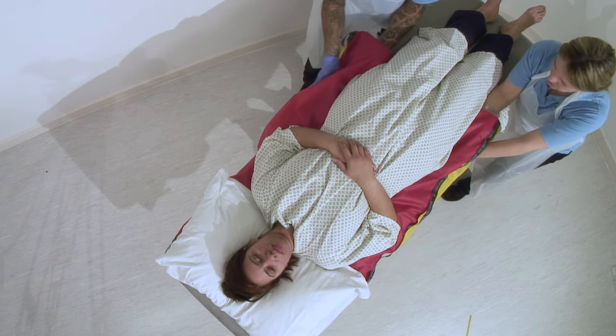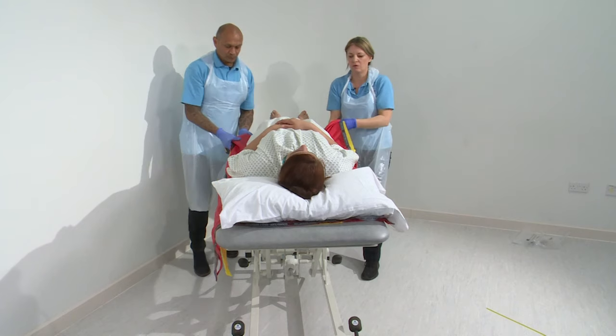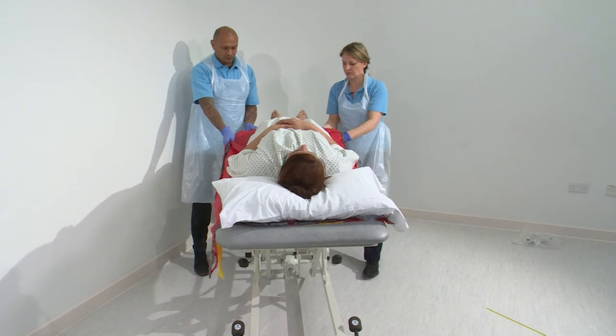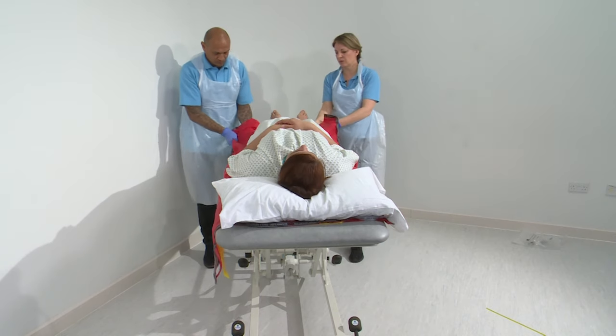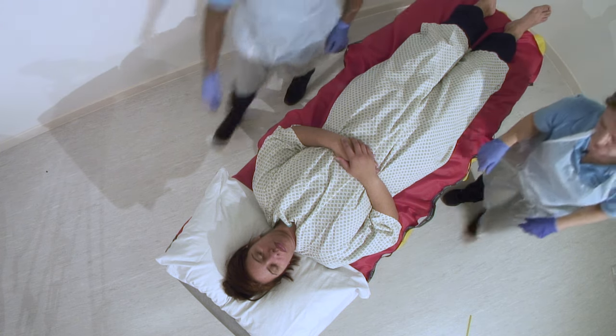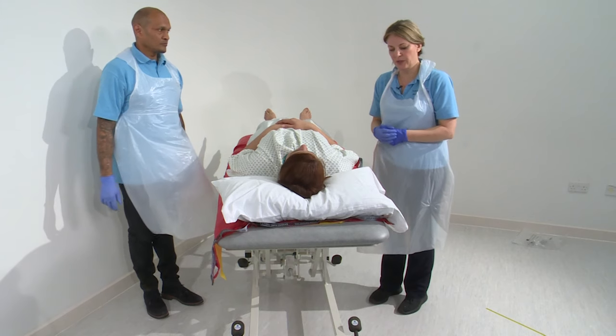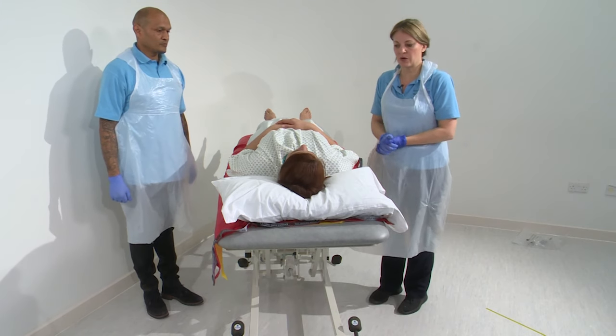And we continue down the patient's body till we've got to the end. Ready, set, slide. Ready, set, slide. And we need to make sure that we've got the heels on the slide sheet. Now we can transfer Niha up and down the bed and we haven't had to roll her to put the slide sheets in.